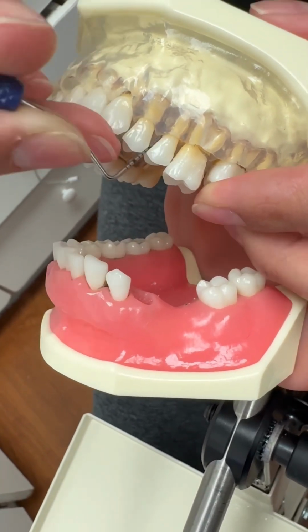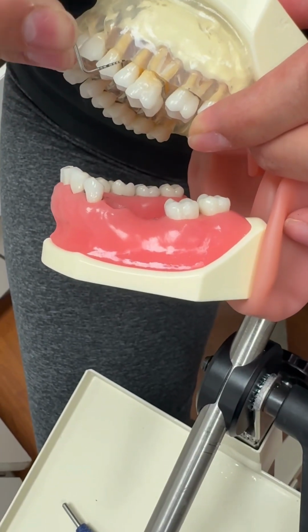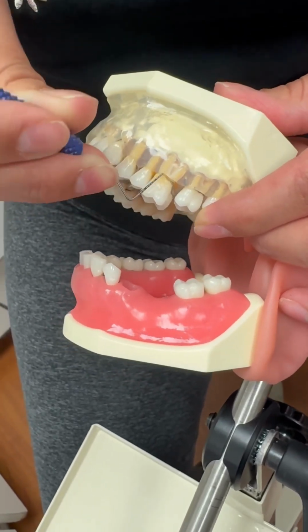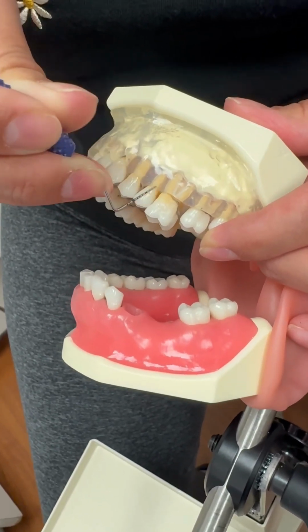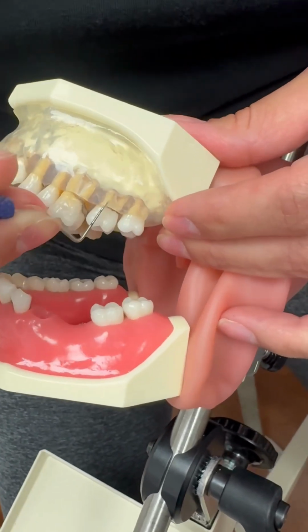The working order is from tooth number 1 on the buccal surface to tooth number 16 on the buccal surface, and then we return from tooth number 16 on the lingual surface to tooth number 1 on the lingual surface.